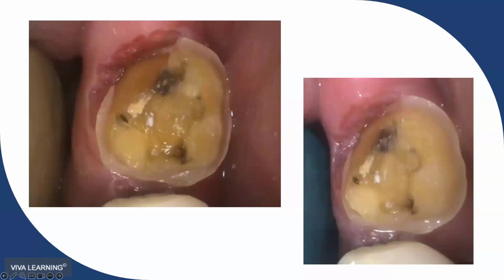So, to that point, the question comes, can you cut crowns off with this laser? Yes, on Emax, it does okay. Yes, on zirconia, it actually breaks the zirconia apart. No on PFM, no on gold crowns. It's not going to cut through metal, right? So in those cases, I might still be using the good old-fashioned handpiece for that.